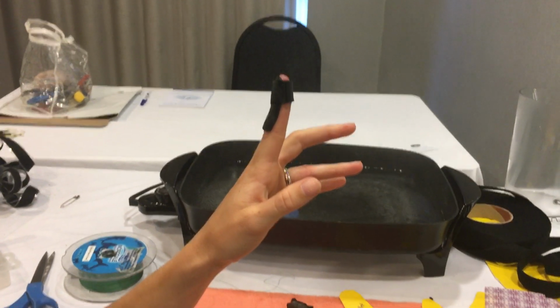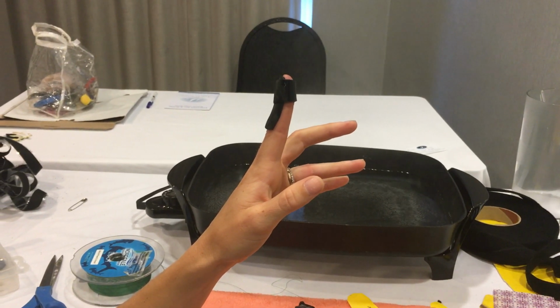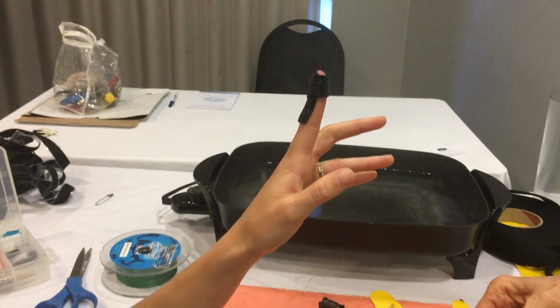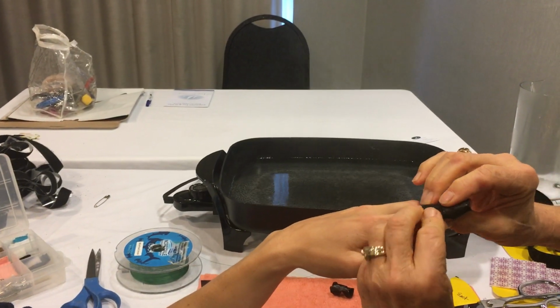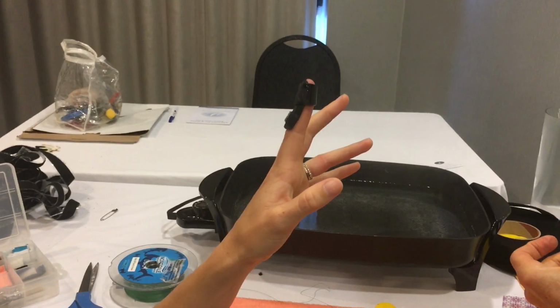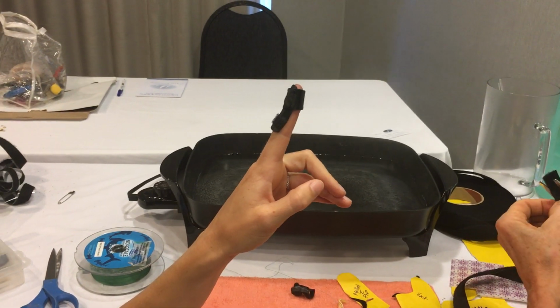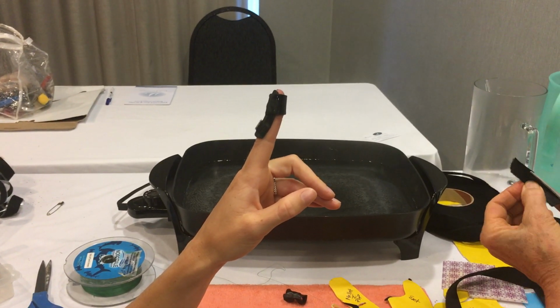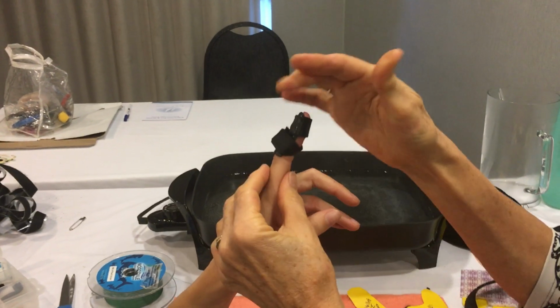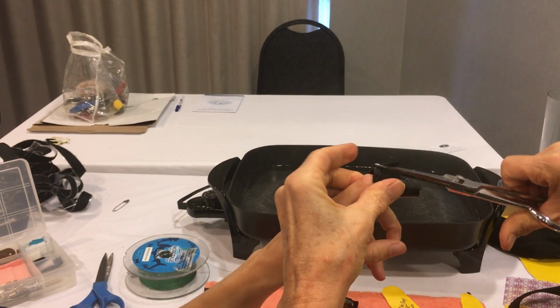And then I'm going to need a strap on the proximal end of the splint to hold it to the finger. Now, I do not have finger strapping material with me, but I definitely recommend the thinner, narrower finger Velcro for securing that proximal strap. But right now I'm going to just use what I have here. So I'm going to cut it a little bit narrower. And you want to make sure that this strap does not interfere with PIP joint flexion. So you may want to cut it up a little bit so the PIP joint can bend. Okay? So again, this strap is a little bit thicker than I would like it to be.